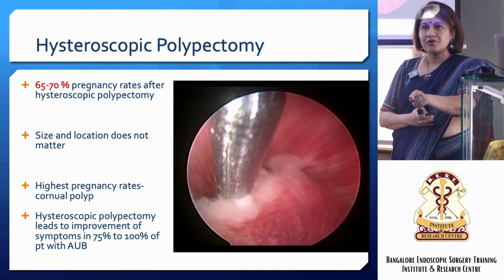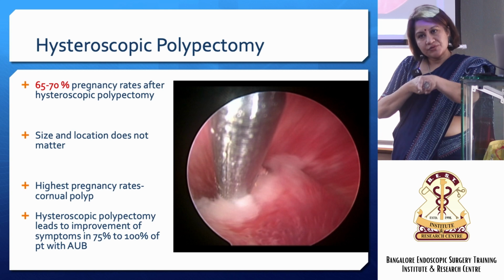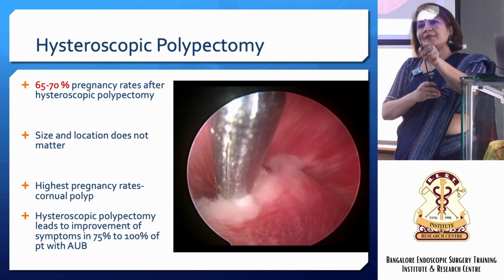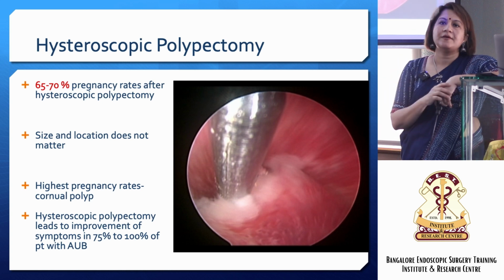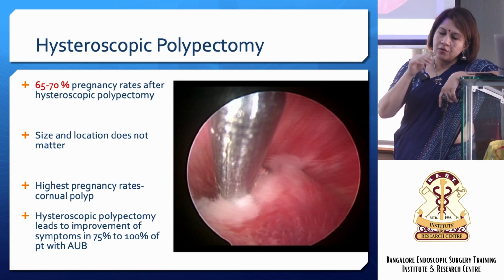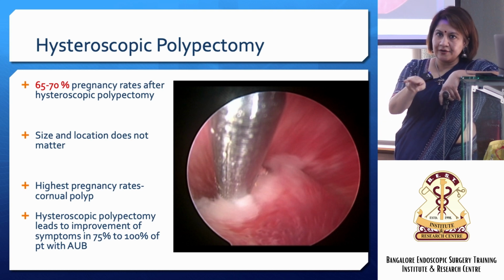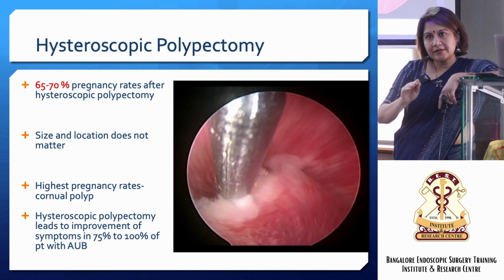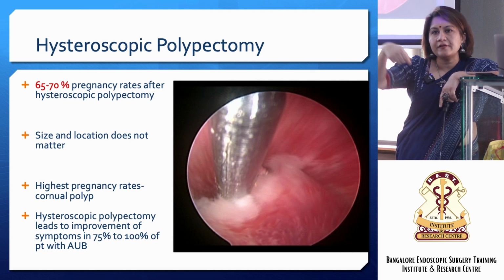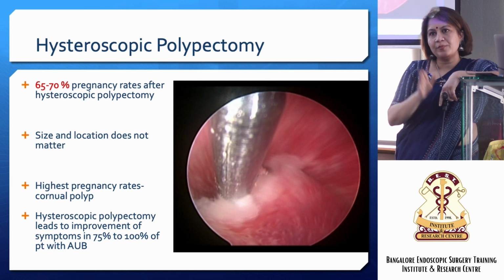So when you come back too much also, you'll be stuck, because sometimes the angulation of those polyps is tough. So you take your telescope, go under the polyp, and lift the polyp with the telescope itself. Mechanically lift it and then put in your scissor and cut it. So don't put the scissor first. Go with the telescope till the base, then slowly bring your scissor out and withdraw your telescope enough to cut the base. So use your telescope, because in hysteroscopy we don't have the luxury of another port to pull things up.